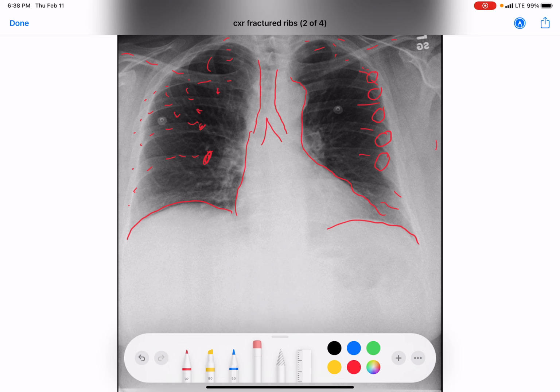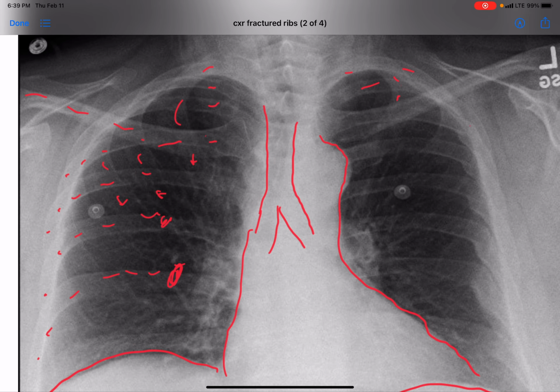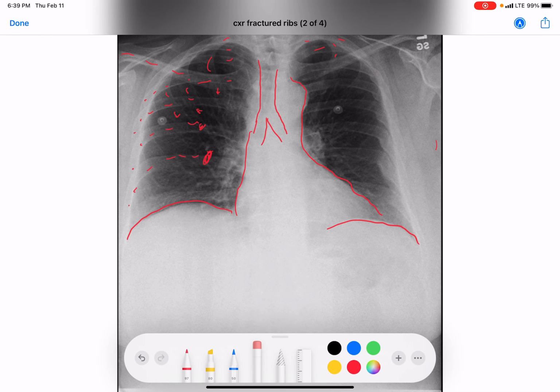I'm going to erase that so we can really look and see if there's a pneumo. And I'm going to get rid of this for a second, blow it up so we can all see here. So you can see there's good vascular markings all the way out. So there's not a pneumo. These little thin lines go all the way out to the edge pretty much. And you can look here, obviously want to see if there's an effusion, and I don't see one. The margins are pretty clear. But it's definitely something to watch for, because more than likely she's bleeding in there.